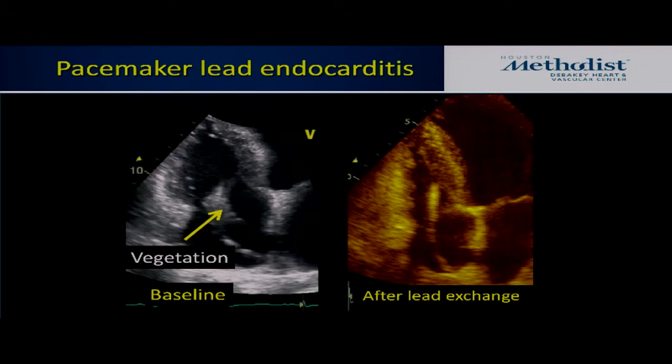So thankfully, there was not contagion onto the tricuspid valve. So simply remove the pacer lead with some trepidation. Hopefully, you didn't have a big embolic event, and that patient did fine. So huge lesions occasionally can be found on prosthetic material.